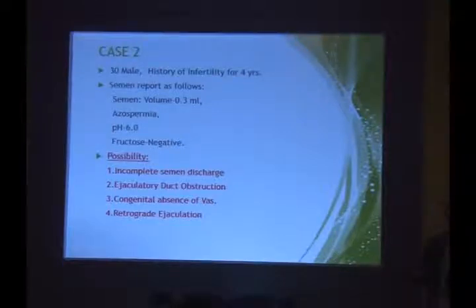So, in retrograde ejaculation, you tell the patient to collect the urine after coitus. If he were to collect urine directly, the urine pH, all of us know, is 6, so the sperms will get killed. But if you give him a culture media with pH 7.5, 50 ml of culture media, and he produces 50 ml of urine after coitus, you will get a live sperm sample. We have more than 10 patients who have conceived after IUI from a case of retrograde ejaculation, with the sperm preparation done in our lab, where you have isolated the sperm sample from the bladder urine mix sample. Okay?